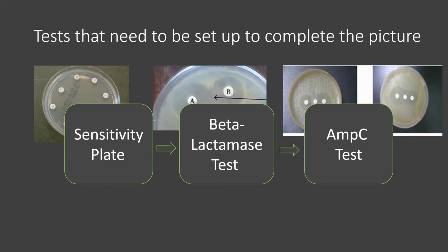This can be achieved for the E. coli via multiple tests. In most clinical settings, we use the E. coli ATCC 25922 as a wild-type quality control strain, with the indicators cephalosporins, cefotaxime, or ceftazidime being used. Biomerieux has also developed an E-test that is used in various laboratories, and these are the more conventional methods of detection.